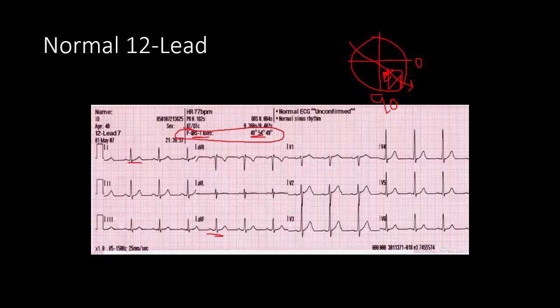Now, what you do notice here in your standard 12 lead is that you don't have posterior leads. Early on in early lectures, I mentioned that there are 15 and 18 lead ECGs as well. Those continue on around and actually give you posterior views as well. Now, we can actually look at some areas for what we call reciprocal changes, which we'll mention a little bit later, and that could give us an indication of a posterior MI.